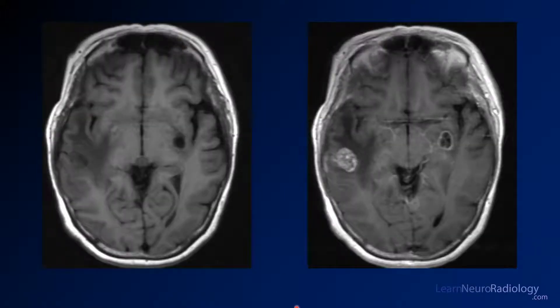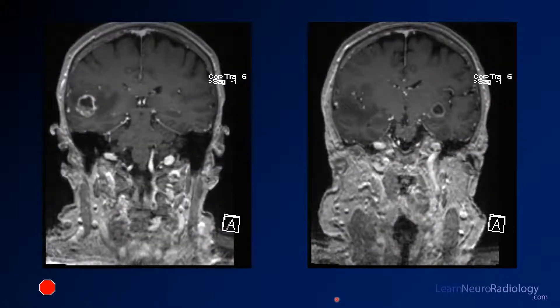On pre and post contrast imaging, the mass is hypointense on pre-contrast and enhances avidly on post-contrast. The lesion in the left basal ganglia also enhances but with a different pattern — centrally necrotic and peripherally enhancing. Additional coronal images confirm those same masses in a different projection, showing again the centrally necrotic areas with peripheral enhancement.